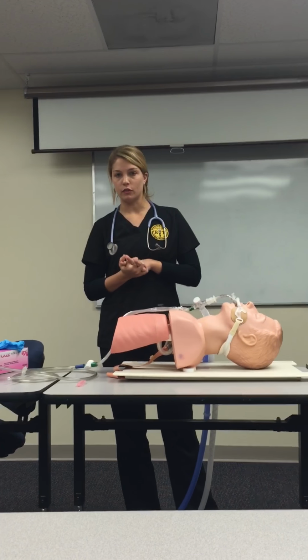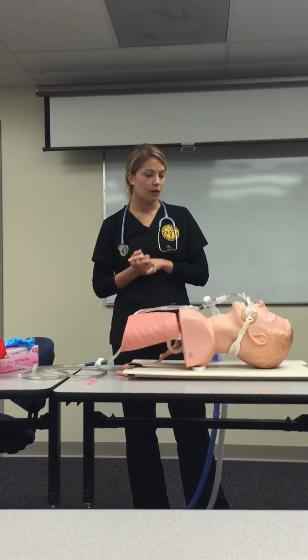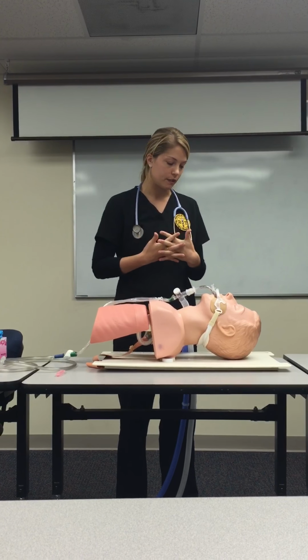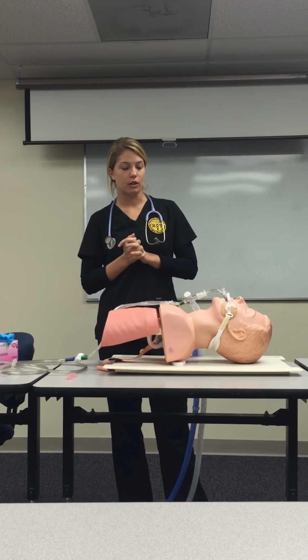Then I would go to my patient's room. I would wash and sanitize my hands before going into his room. Upon going into his room, I'd introduce myself. Hi, Mr. Doe, I'm Lauren from Respiratory. I'm going to be suctioning you today. Then I would check and make sure that I have the correct patient.